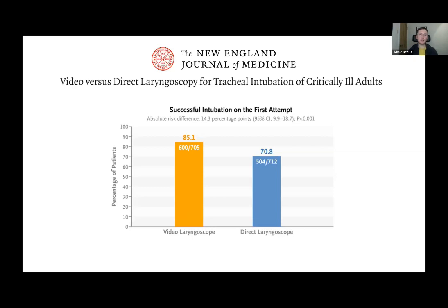Interestingly, in the study, most experience within all of the intubators was with videolaryngoscopes, and that's a massive sea change from most of those studies that are included in that Cochrane collaboration review. And you did also see that the effect size about improvement that you see with videolaryngoscopy is reduced in people who are really experienced with direct laryngoscopy. And I think that's one of the things that makes me question the external validity of this study when we compare it to our own practice in the UK.